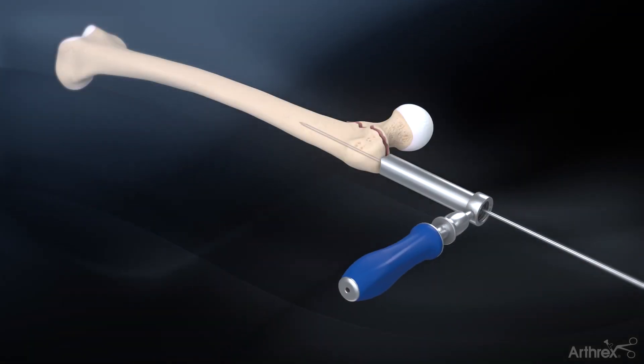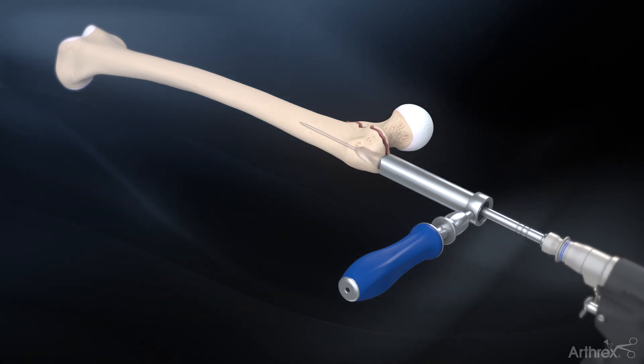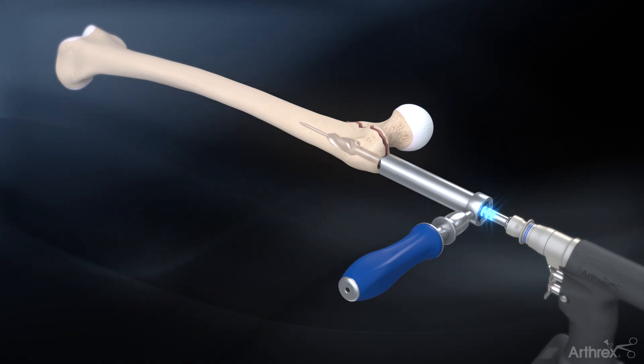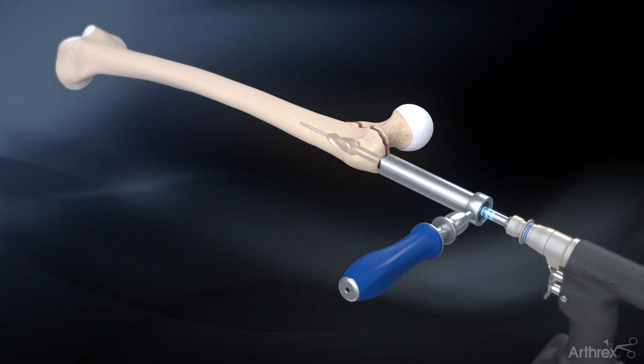Remove the black pin guide and ream over the guide pin with the 16.5 mm cannulated entry reamer. The entry reamer has grooves which are read from the top of the soft tissue protector. The grooves indicate the reaming depth needed to insert the nail flush, 5 mm, or 10 mm deep into the femur.